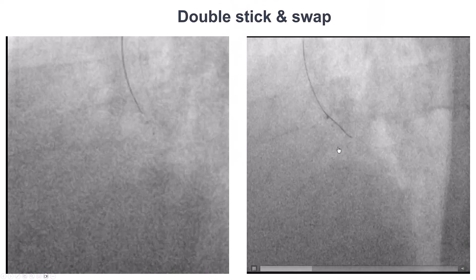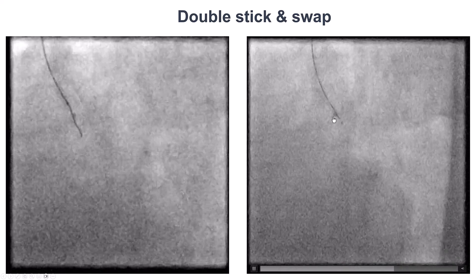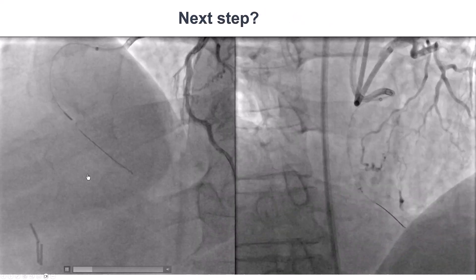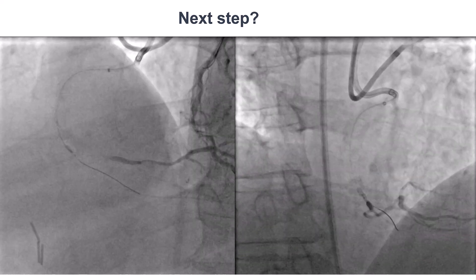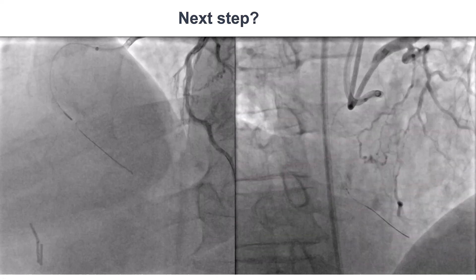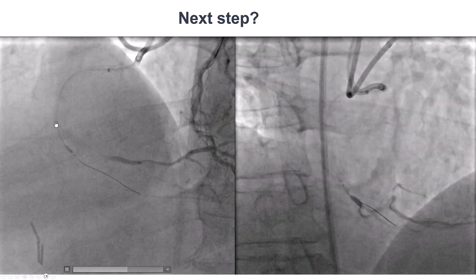The double blind stick and swap technique was used, sticking through both exit ports — proximal to the proximal marker as well as between the two markers. The wire seemed to be advancing, but then the contralateral injection revealed we were not in the right coronary artery. It was unclear whether we were in a marginal branch or completely out of the vessel, but there was some staining.